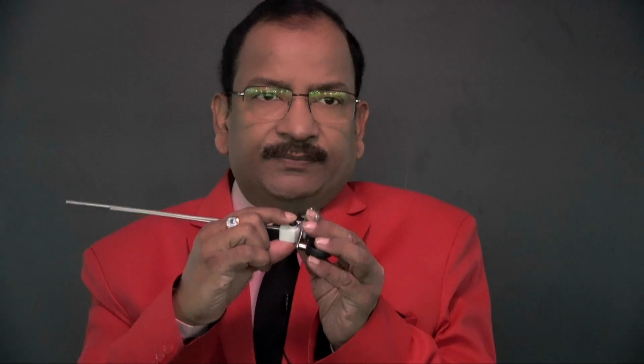First you will take the working element. Working elements are of different types, active and passive. After that there is a knob here. You will press this knob, and then you will drop the electrode. I am dropping the electrode.